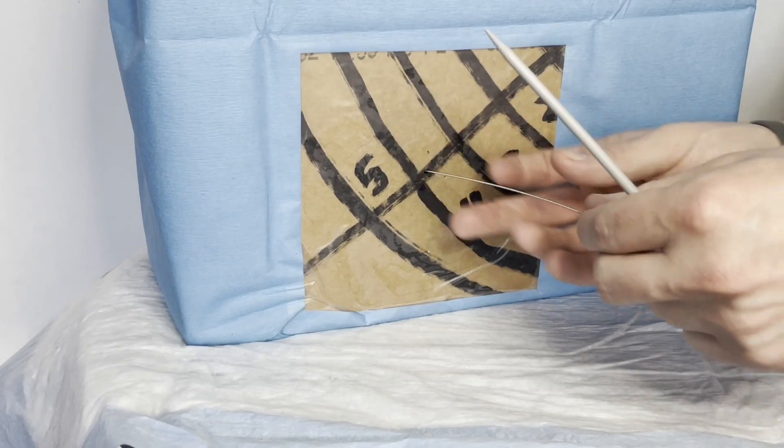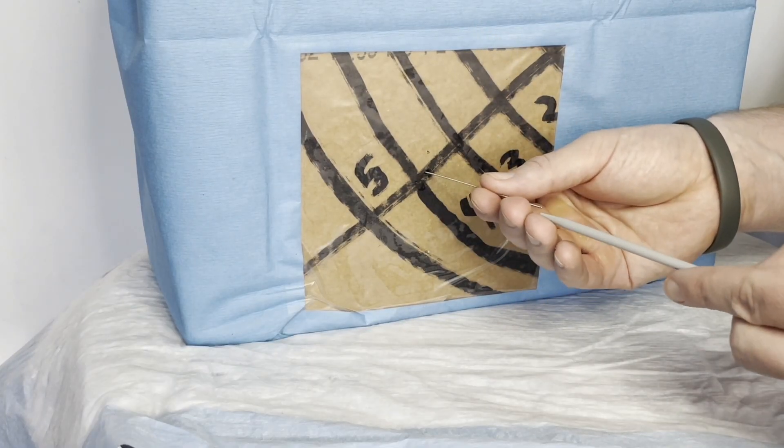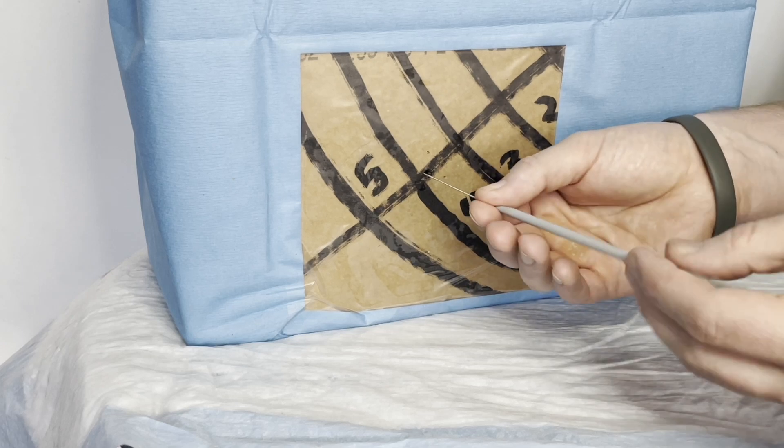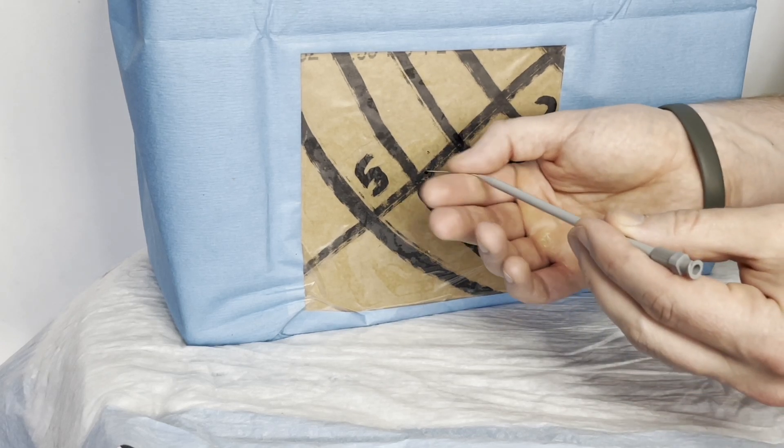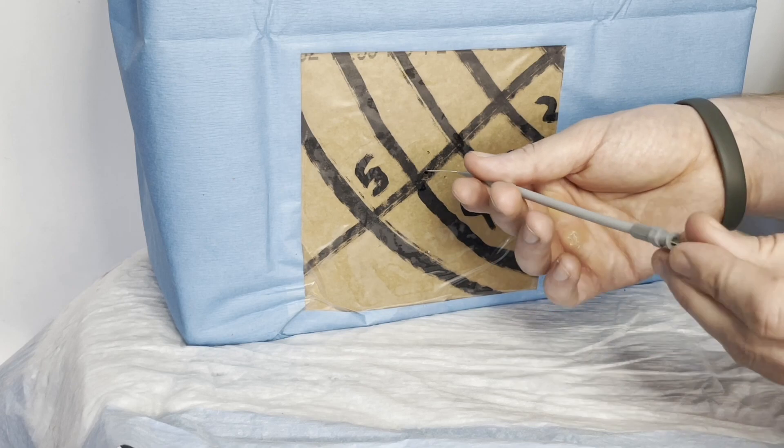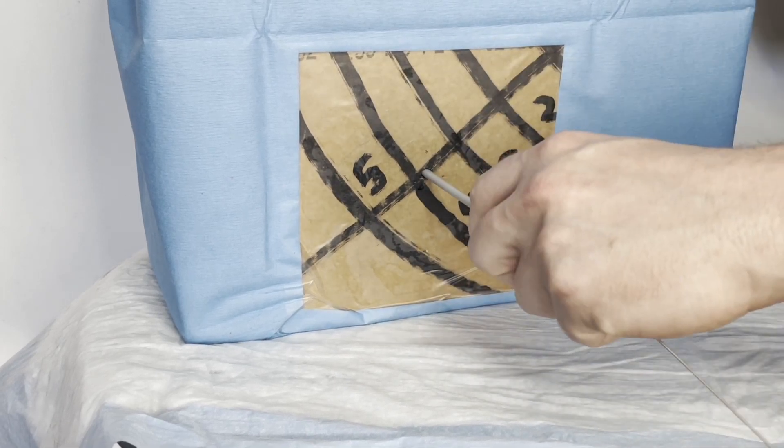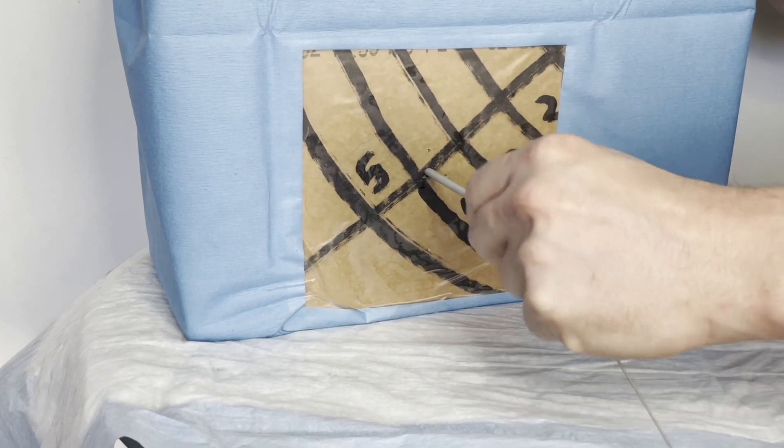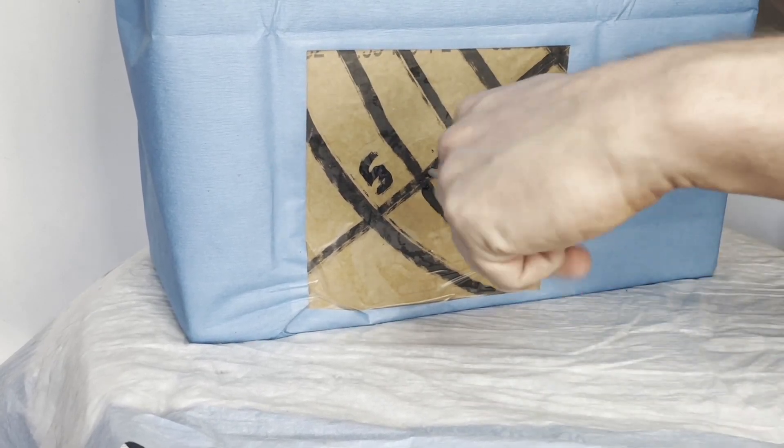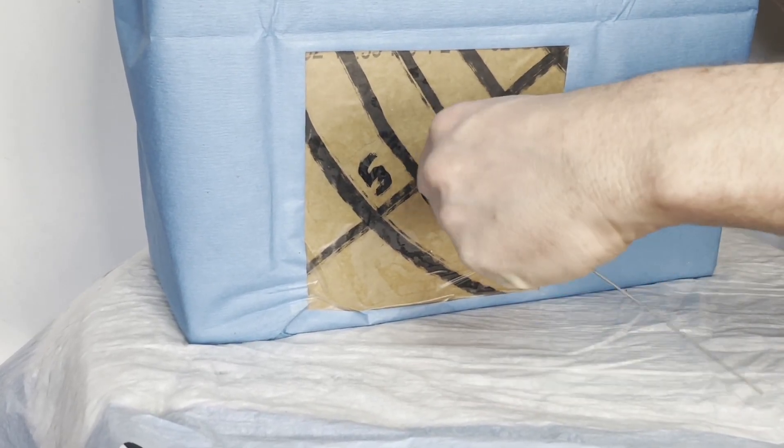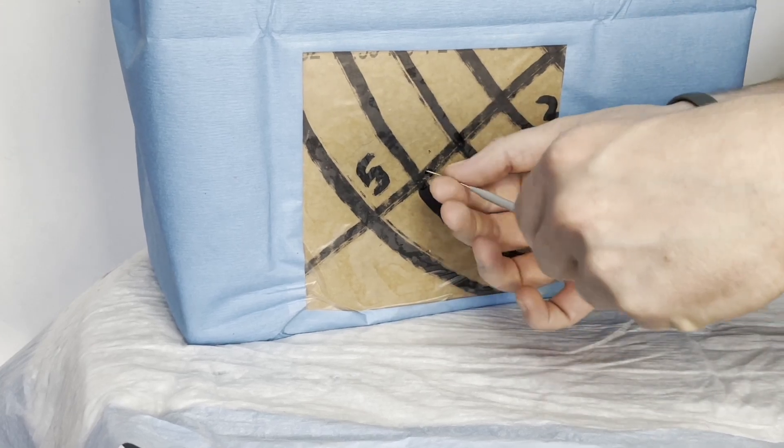Now that our stab incision is done, we've now created a hole big enough to dilate the area. We've grabbed our dilator. We're holding on to the guide wire. And now that we've got our dilator close to the skin, we want to push and twist the dilator. We're not going a full eight centimeters in; we're just going enough to create that pocket even bigger.